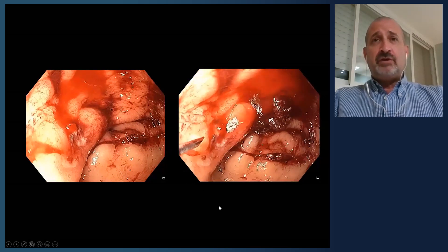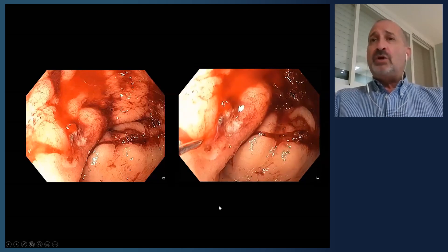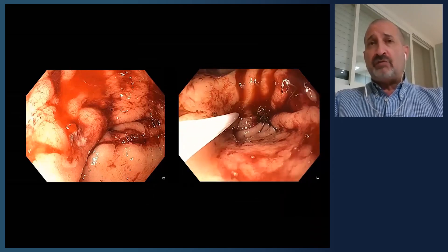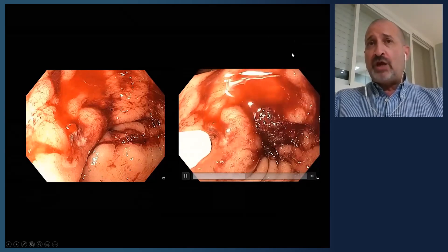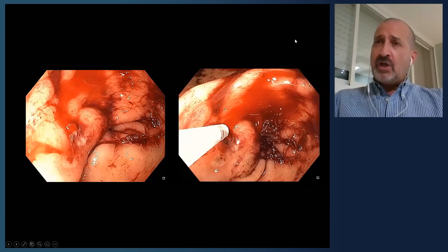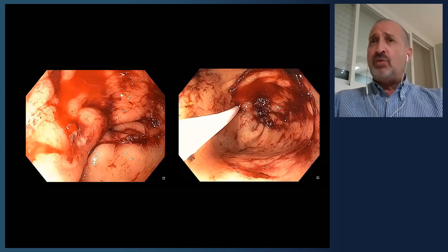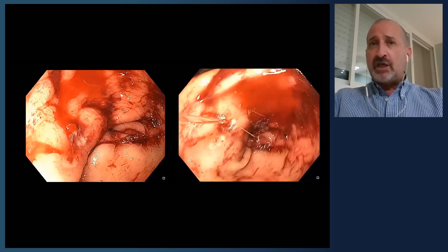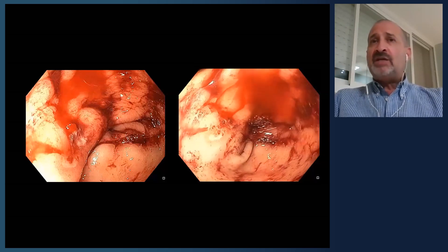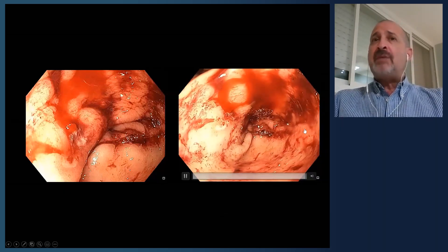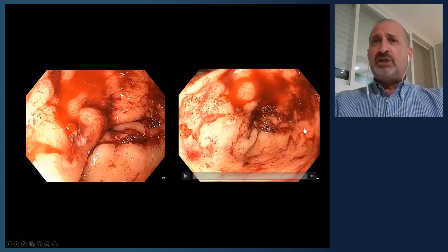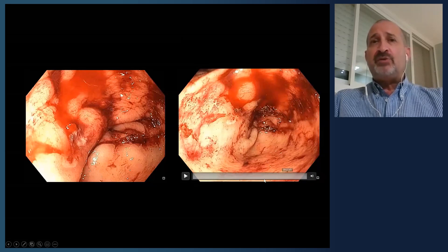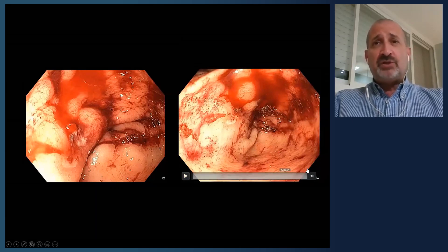Combination endoscopic therapy is recommended. You can see the ulcer with active bleeding. First, we inject around the area with dilute epinephrine — 1:10,000 epinephrine, injecting 1 to 2 cc's in four quadrants around the bleeding area. This slows or potentially stops the bleeding and helps visualize where it's coming from, so a clip can then be placed.